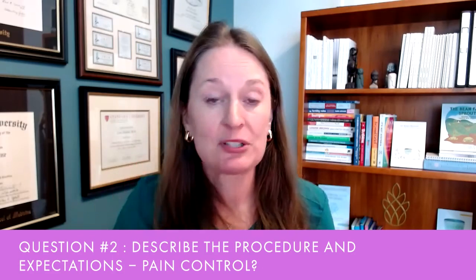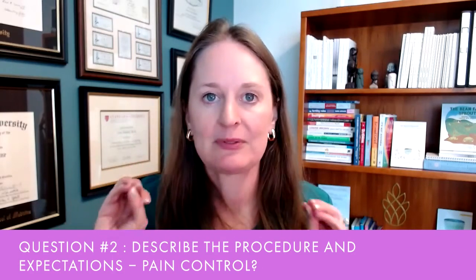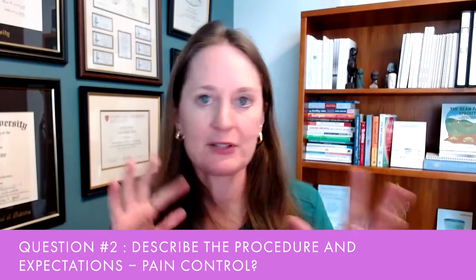Okay. Question number two, have the doctor describe what it's going to be like for you. Whatever test they recommend, have them walk it through, because every clinic is different. Every setting is different. If they're referring you somewhere, you should get information about what it's going to be like. For example, when we do hysteroscopy at Pacific Northwest Fertility in Seattle, we offer nitrous gas. So it's like getting laughing gas at the dentist.